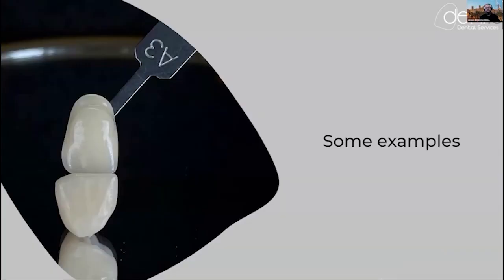I want to show you some examples of some cases I have been doing with Class 2A approved materials. For example, this one is an anterior crown in an A3 color. All I've done is a little bit of polishing. And you see, we get a really high aesthetic result.